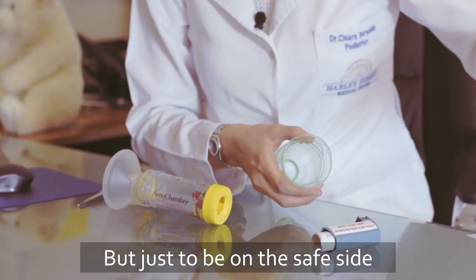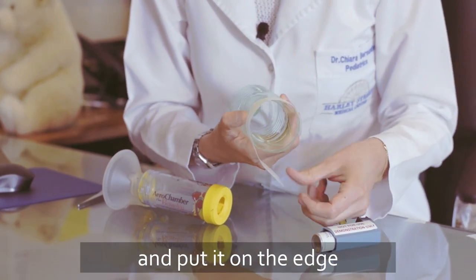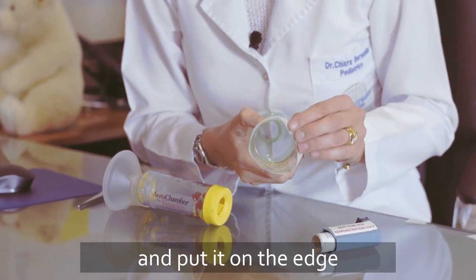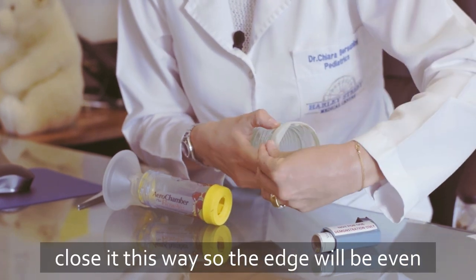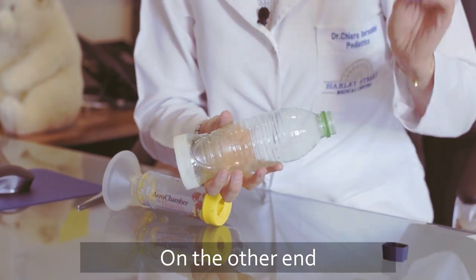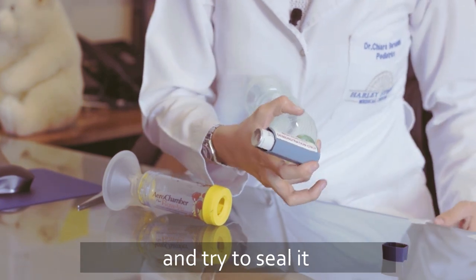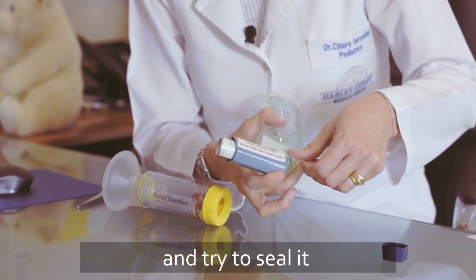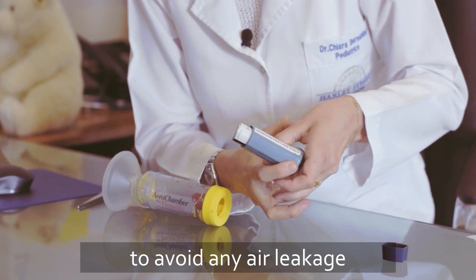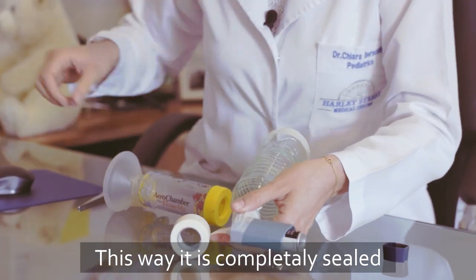the safe side, you can have some tape or some plaster and put it on the edge, close it like that, and the surface would be even. On the other end, you put your spray. You try to seal it in order not to have any air leakage. This way it is completely sealed.